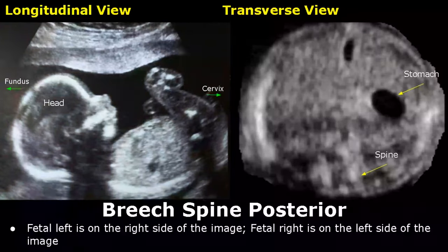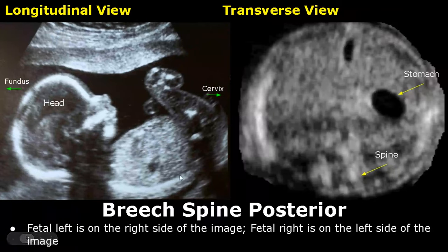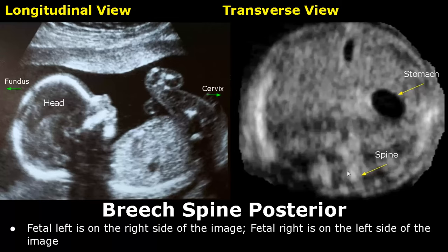Breech spine posterior is an orientation of breech presentation. The spine is located on the lower side of the image in both longitudinal and transverse views. In a transverse view, the stomach is seen on the right side of the image, so fetal left is on the right side of the image.